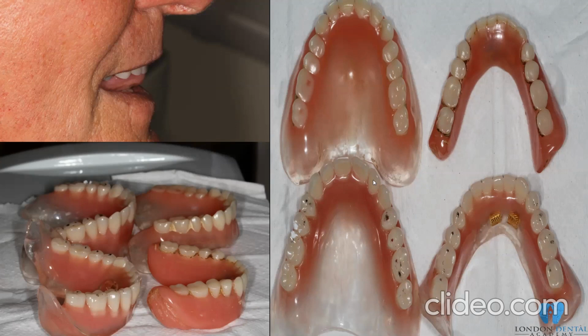If you engage the anterior teeth in the guidance, and if you want to ask later at the webinar, please do ask. But just to make you aware, you have to have space in the ICP, RCP position between upper and lower anterior teeth, and do that across the board, even with implants. So make sure you have a little bit of gap and space there. When we get into action, then the engagement of the posterior teeth will help the anterior teeth, but at the same time reduce the risk of breaking the posterior support or the posterior seal.